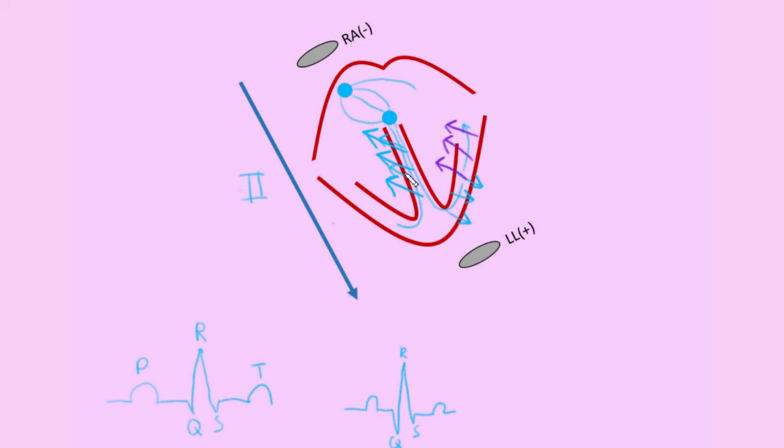So hopefully this video gives you a better understanding of how the direction of the electrical activity of the heart gives us the different EKG tracings we see in the various leads.